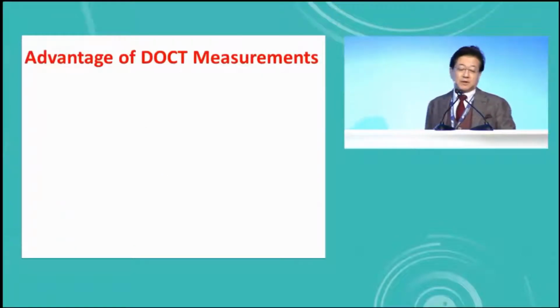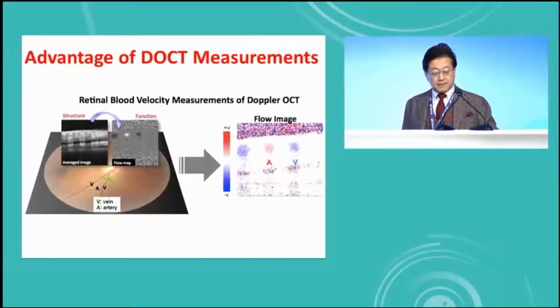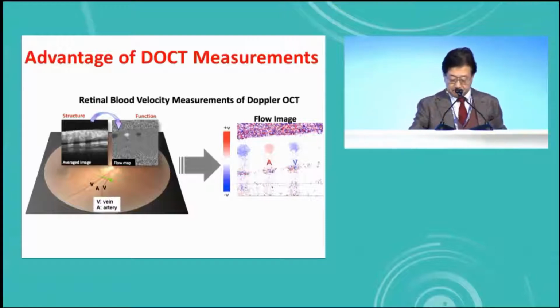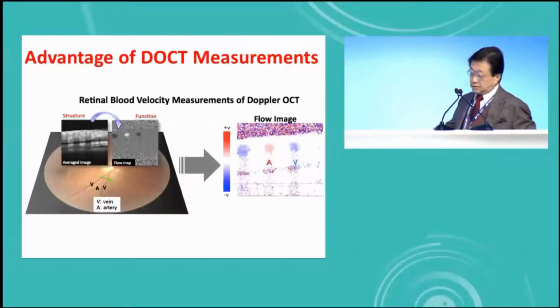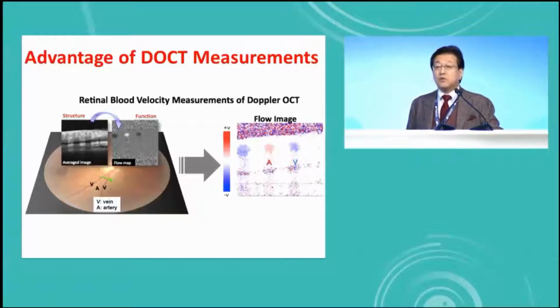As for the advantage of a DOCT measurement, since we have an OCT, OCT can of course take a structural image, and also get a functional image, and from these two, we have a flow image.